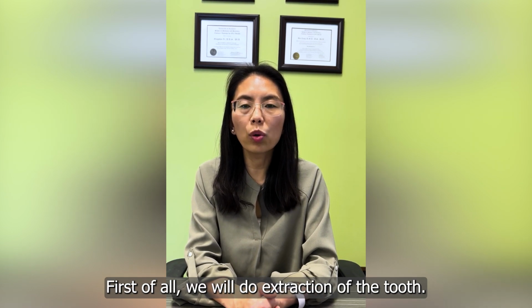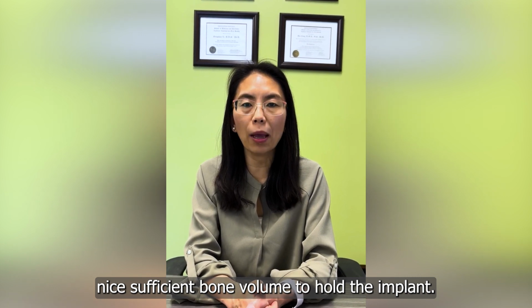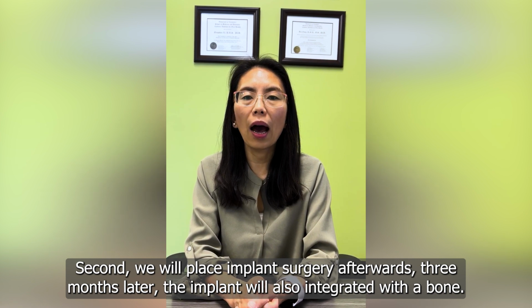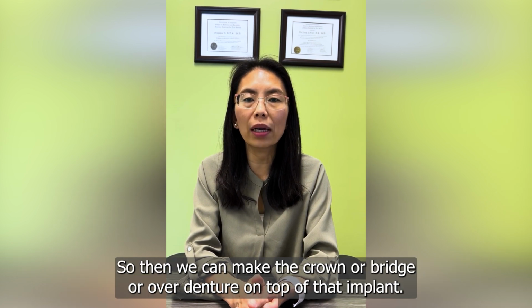First of all, we will do extraction of the tooth. Second, after tooth extraction, we will do a bone graft to make the site suitable, with sufficient bone volume to hold the implant. Then we will place the implant surgically. Afterwards, three months later, the implant will have integrated with the bone, so that we can make the crown, bridge, or overdenture on top of that implant.